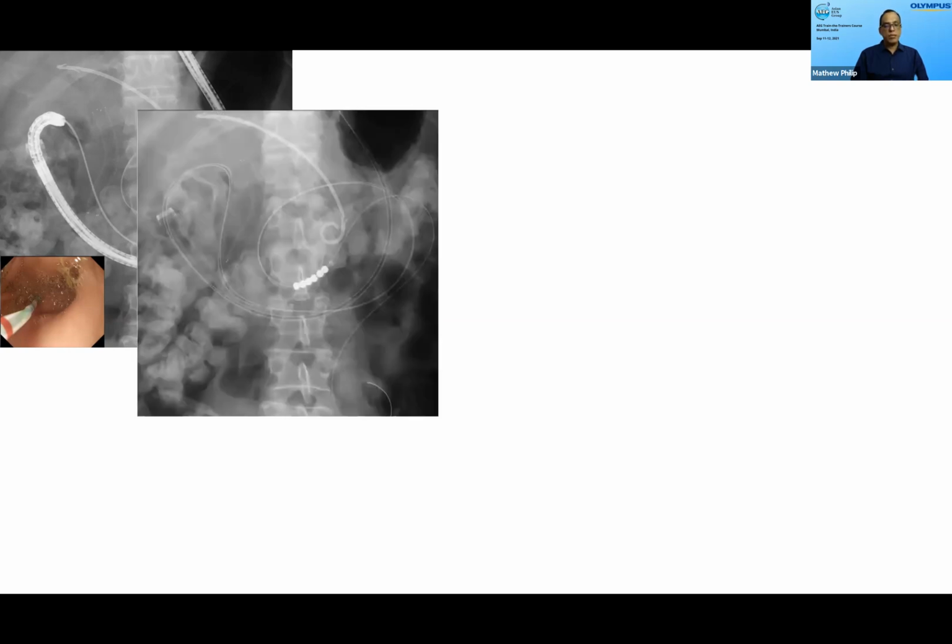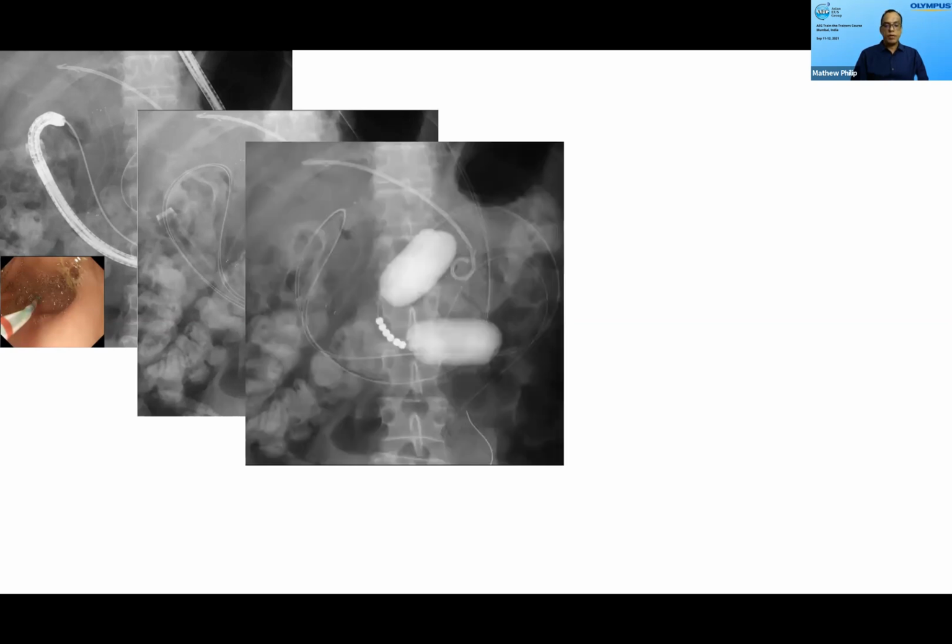So this is actually just to show you how the technique is being done again. Over tube, then you pass a tube, endoscope, guide wire, over the guide wire, E-pass or the double balloon enteral tube, and inflate the tube balloons with contrast, and then the segment of bowel you selected is filled with the contrast and methylene blue and saline, and then you puncture and complete the procedure.